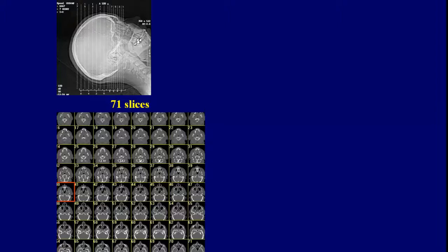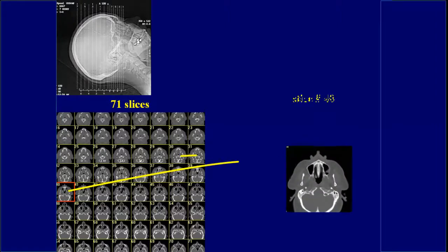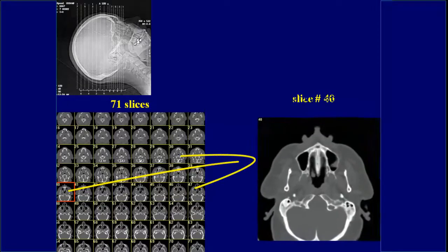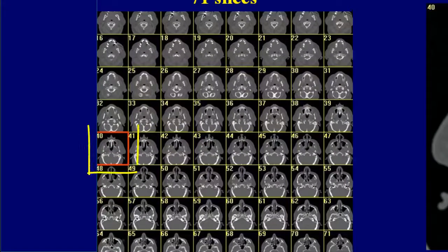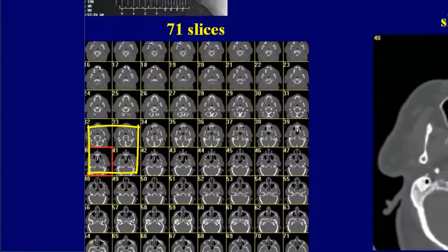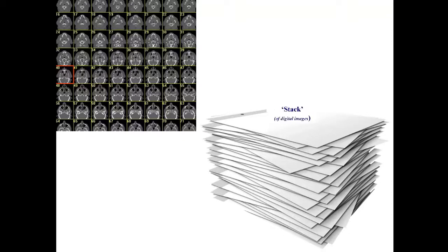However, this is not a very convenient display for studying and finding trauma and pathologies. It is preferable to look at one slice at a time. This is slice 40, taken from this location right here. When organized and stored on a DVD, all 71 slices through this patient head will be put into a digital pile of images called a stack.